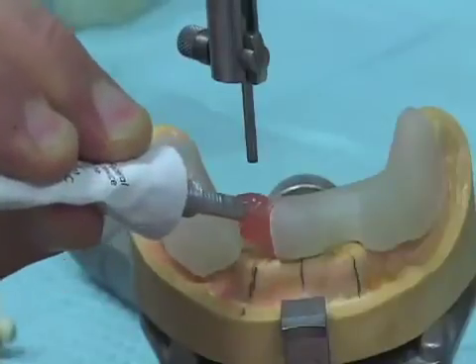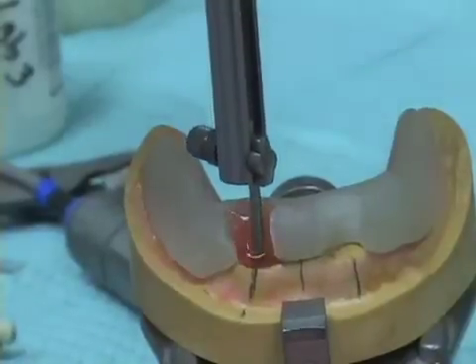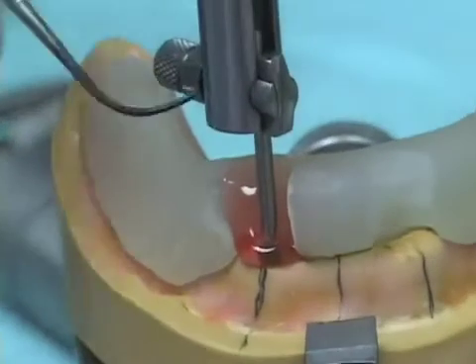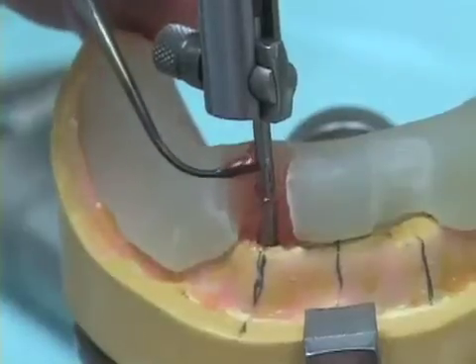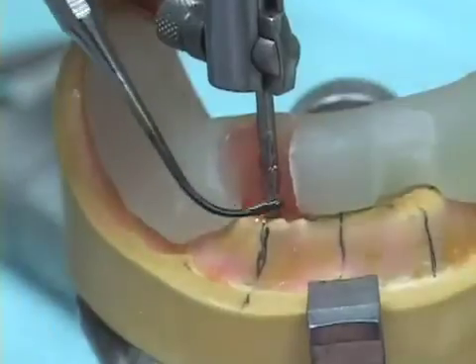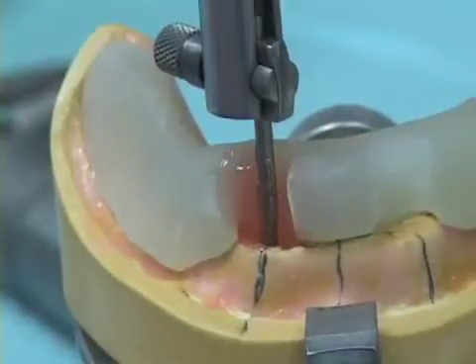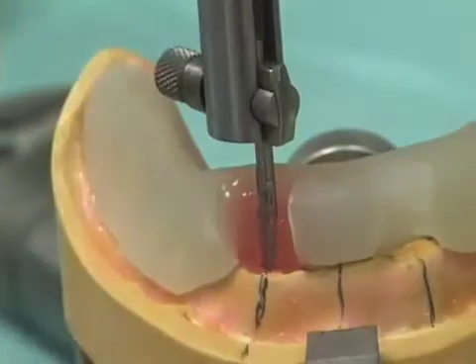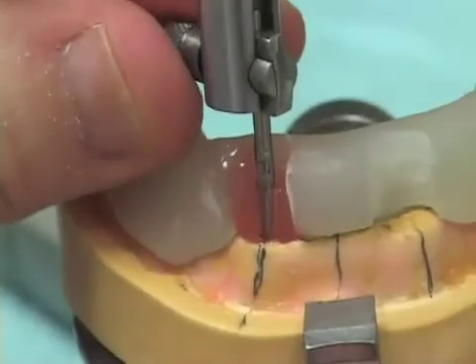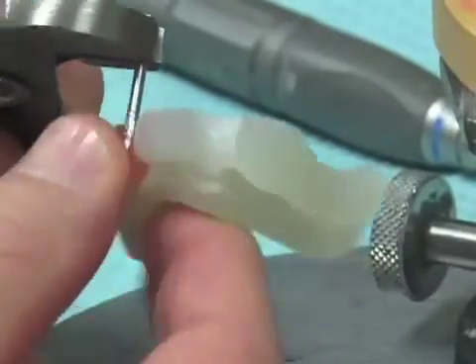Now remember, unlike our x-ray guide for making surgical guides, it's only necessary to surround the lingual 180 degrees of this drill blank. So again, I like to use the large P.K. Thomas instrument for coaxing or positioning the triad gel. And again, I may cover a little bit of the buccal or labial aspect of the drill blank at this stage, but all I really need when we're all done is the lingual 180 degrees of that drill blank surrounded by the triad gel. We've cured this material for 20 seconds from each side, so here again we just loosen the knurled nut, lift the vertical spindle of our surveyor straight up in the air, and first grasp the drill blank and twist it, and then lift it.